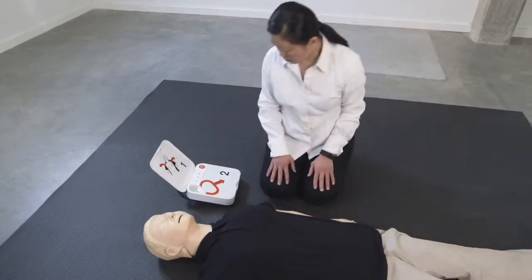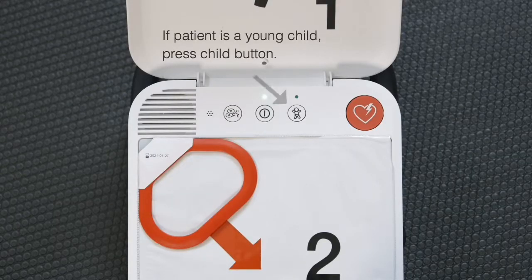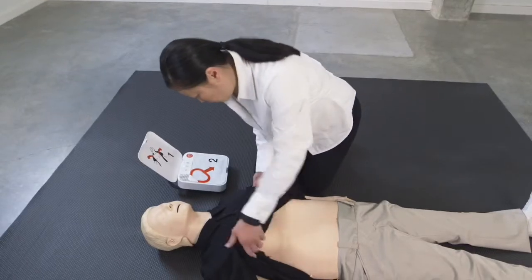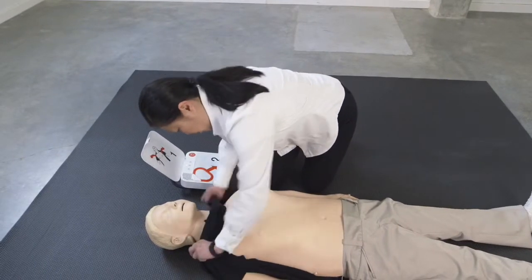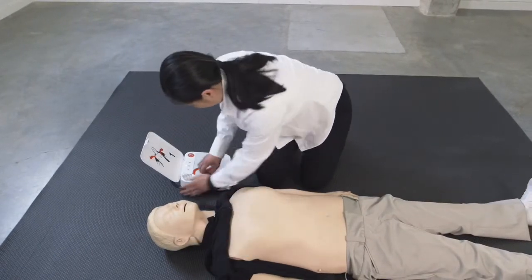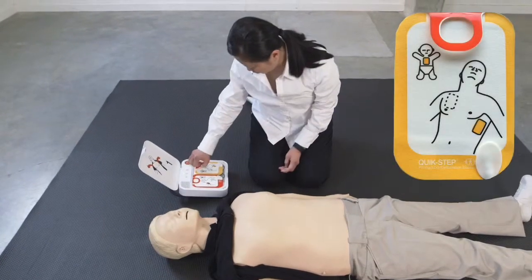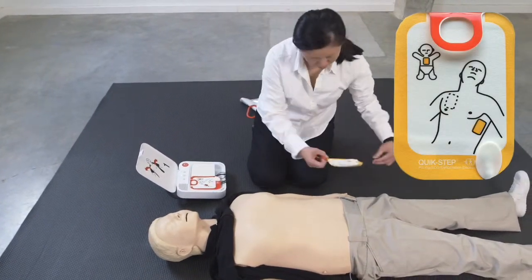Adult mode. Remove all clothing from the patient's chest. Pull the red handle to reveal pads. Look at the pictures on the pads. Apply pads to bare skin exactly as shown in the pictures.